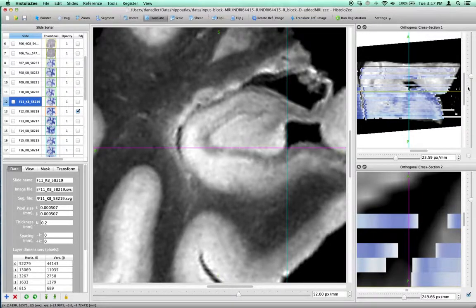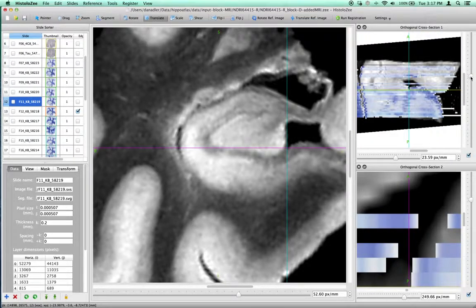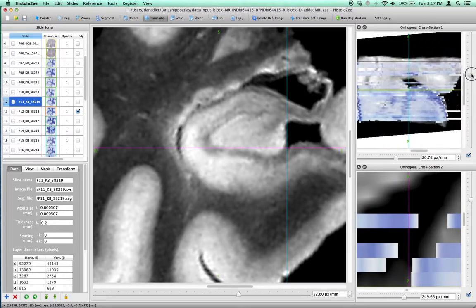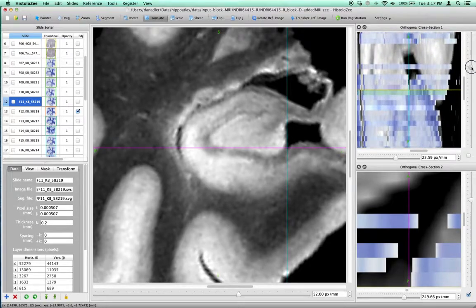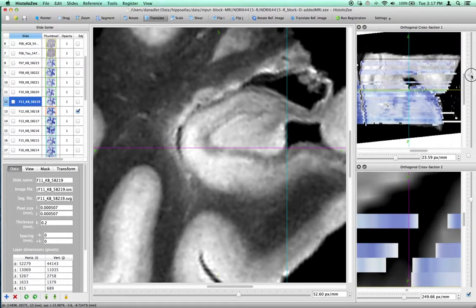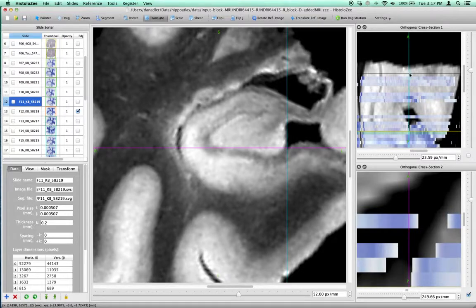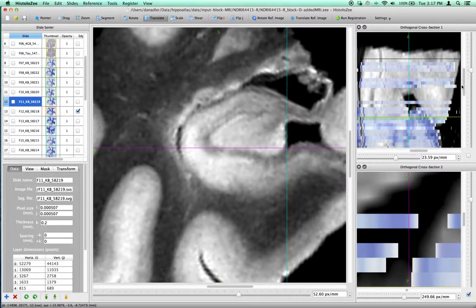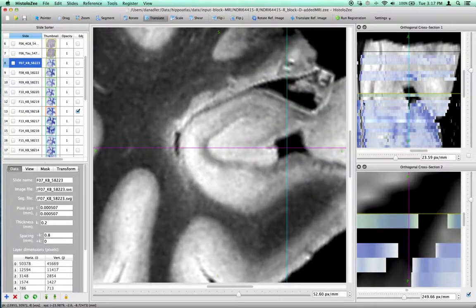And again, we can fix zooming in horizontal and vertical directions in the orthogonal views, or we can choose to not keep horizontal vertical aspect ratios. This is handy for viewing all the slides in a stack. The origin of the stack, i.e. the k equals 0 index location, is at the very top here. So let's click on this slide here and view it.